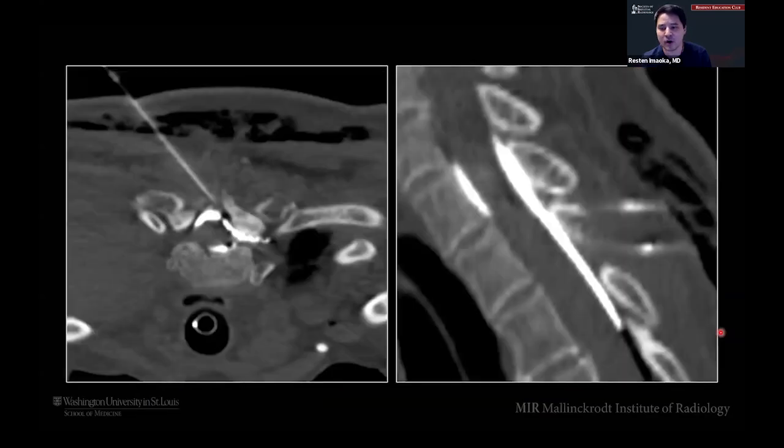Here's an example of more active thermal protection, right? Here we're doing a cryo of the posterior elements of the spinous process. You've got a needle coming down. We're getting an epidural with contrast here to physically displace the thecal sac and the cord away. And then you can also see a little bit of CO2 here in the subcutaneous tissues to push the skin away from the tumor here.